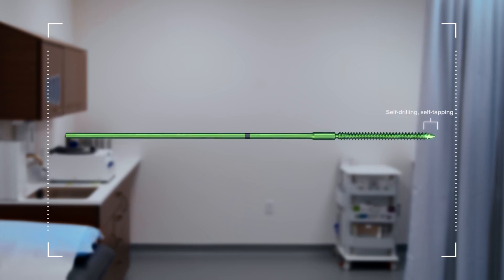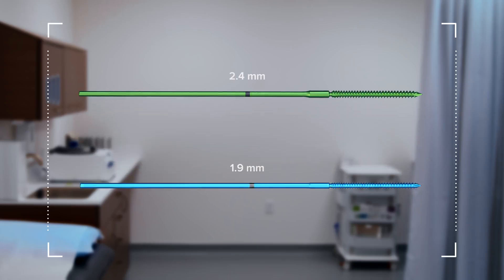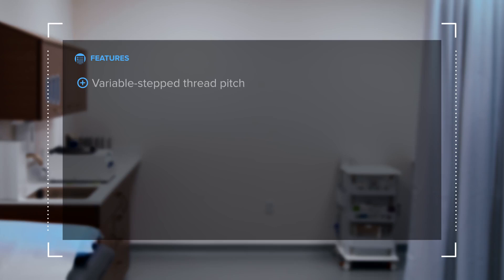Unique features of the snap-off compression pin that make it stand in distinction to fully threaded K-wires or non-threaded K-wires is that they feature a variable step thread pitch, much like a Herbert screw or a headless compression screw, which gives about two to three millimeters of compression when the pin is placed orthogonal to a fracture plane. This feature makes them uniquely applicable to upper and lower extremity trauma applications, particularly periarticular fractures.